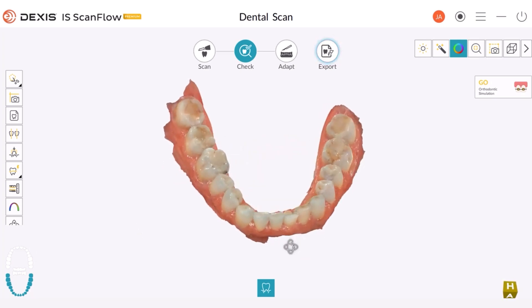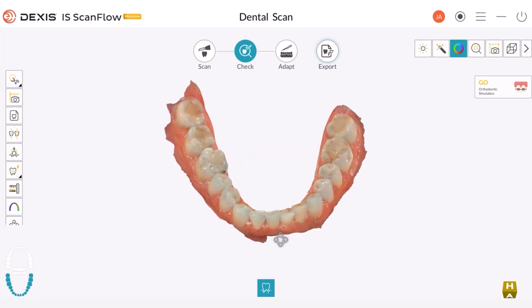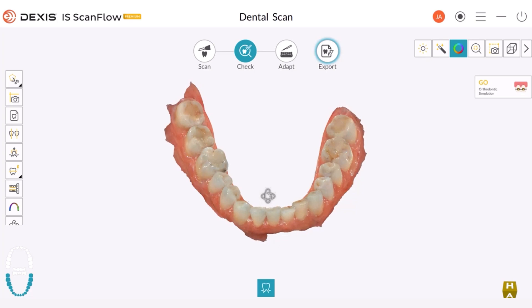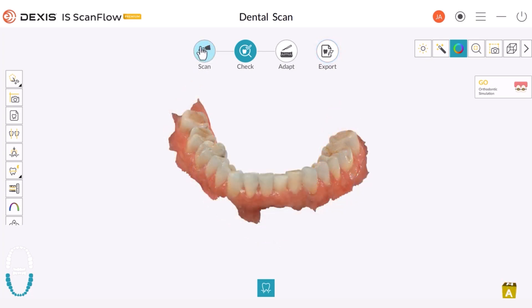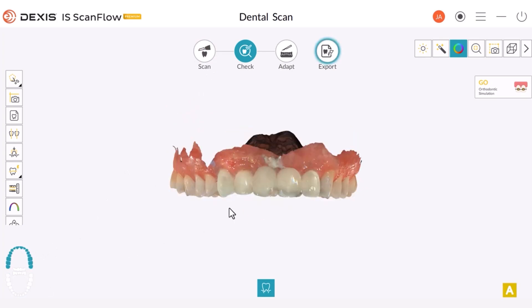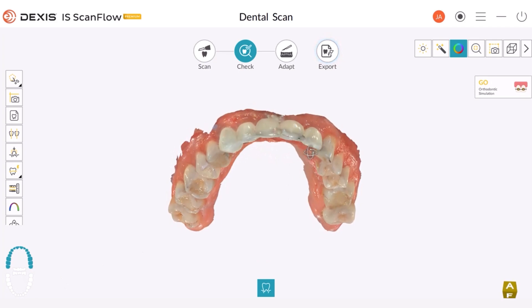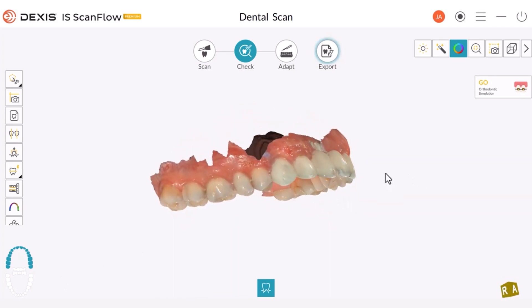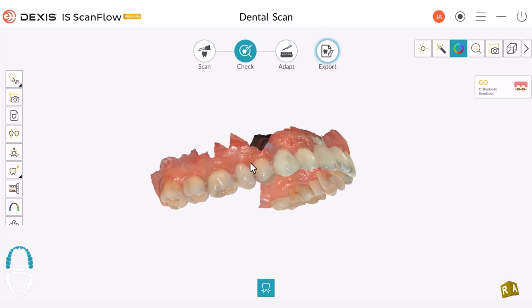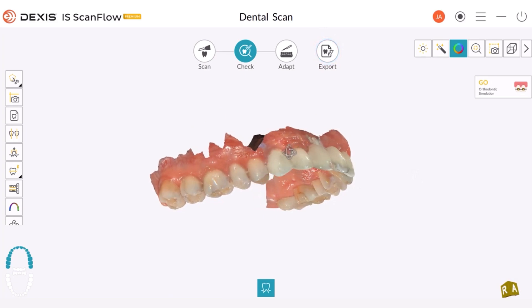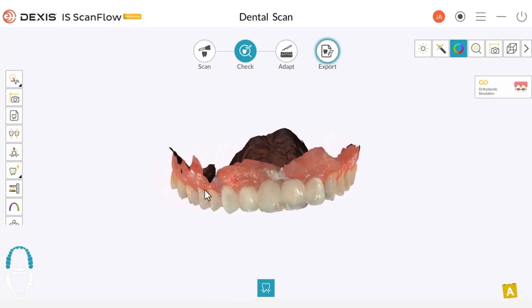This refined scan will help us meet a variety of needs. At this phase, we can return to the scanning process by clicking Scan if necessary. We can also switch our focus to the upper arch. Here I got a little close to the gingival margin, but I did capture some soft tissue around the tooth.